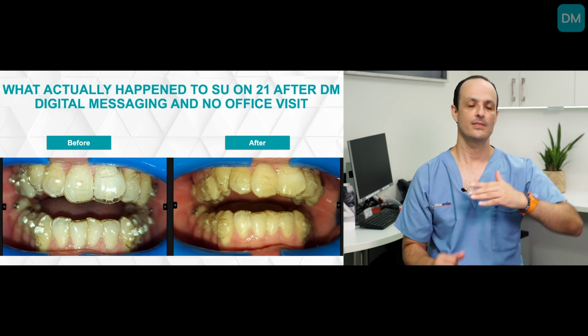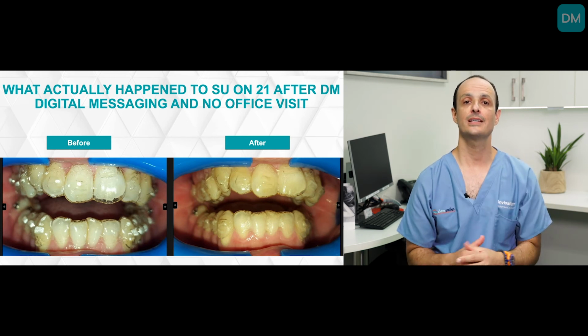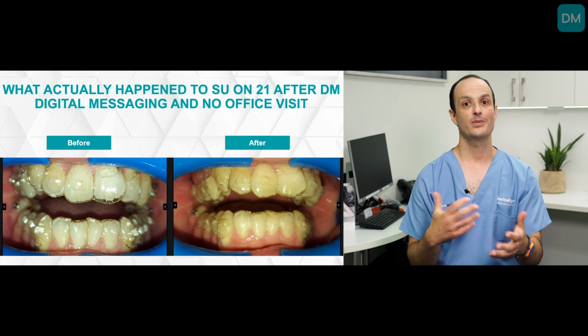And so you can imagine if this person just progresses with their aligners, things can really go off track a lot, to the point where it's unrecoverable. Worst case scenario, but depending on how many aligners you've given them, they'll come back in a number of aligners, in weeks, and then now you've got a really serious problem to deal with. You're going to have to backtrack, if you're lucky, button, elastic maybe, whatever, but that's avoidable with the dental monitoring process, because we're notified really quickly about any kind of slide unseat, and you can get onto those problems quickly.